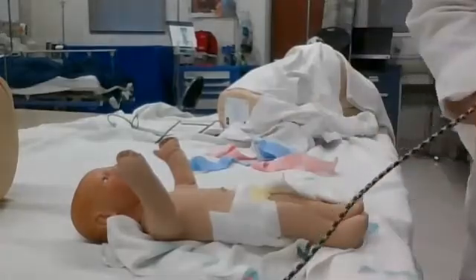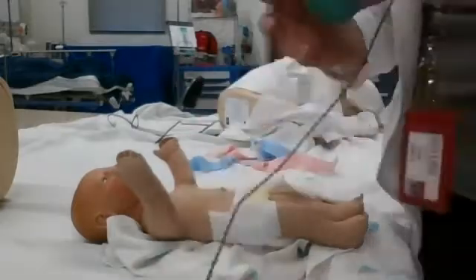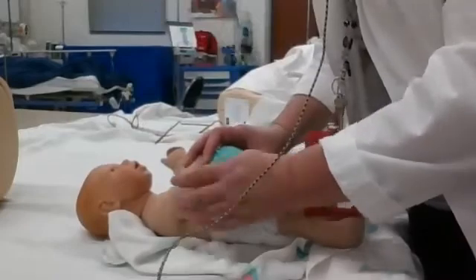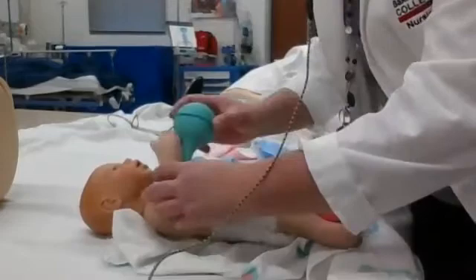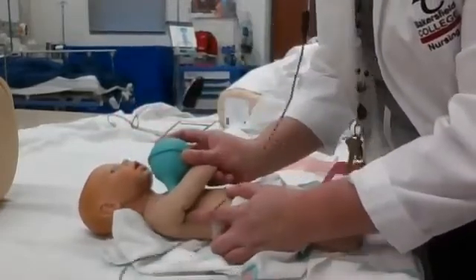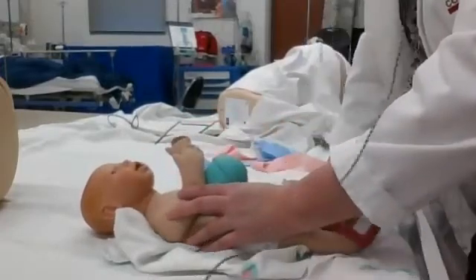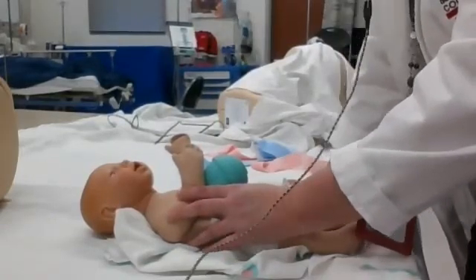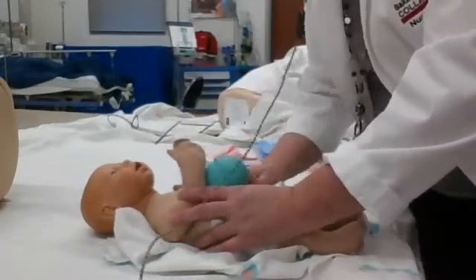When taking the temperature, we want to make sure we're putting the temperature probe up underneath the baby's arm, and then hold the arm down. Make sure the tip is not poking out the end, or you won't get an accurate temperature. We're going to do the temperature last, because this sometimes irritates the baby — then they'll be crying and it will be very difficult to hear their heart and lungs.